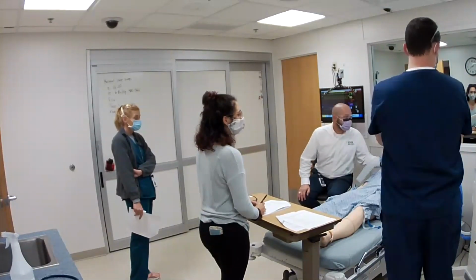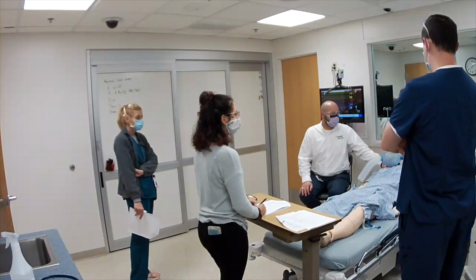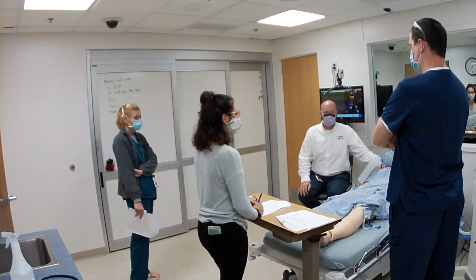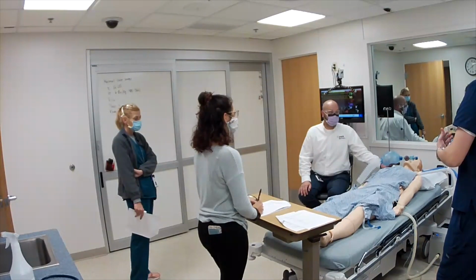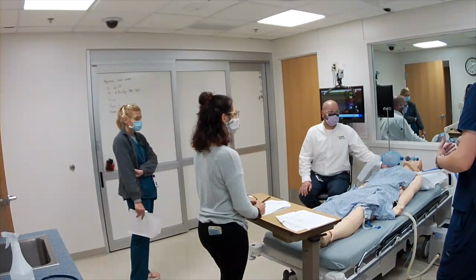Trying to think exactly what it stands for because it's been a while. It gives the patient the chance to spontaneously breathe and gives the support, the pressure support set for the extra breaths and not a full volume breath. Yeah, absolutely. So it stands for synchronized intermittent mandatory ventilation. It's one we use a lot, isn't it? Yes. Yeah, we have a lot of patients on SIMV.